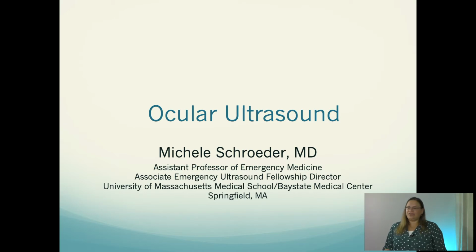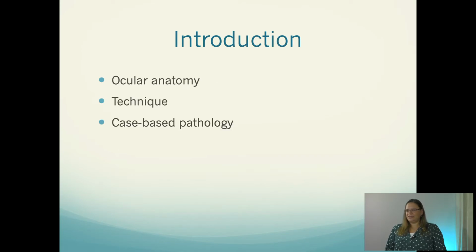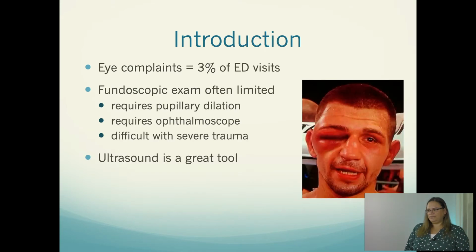And today we're going to be talking about ocular ultrasound. I don't, unfortunately, have any financial disclosures. We will be talking about ocular anatomy, go over the basics of the technique of ocular ultrasound, and then I'm going to go into a case-based demonstration of the common pathology.